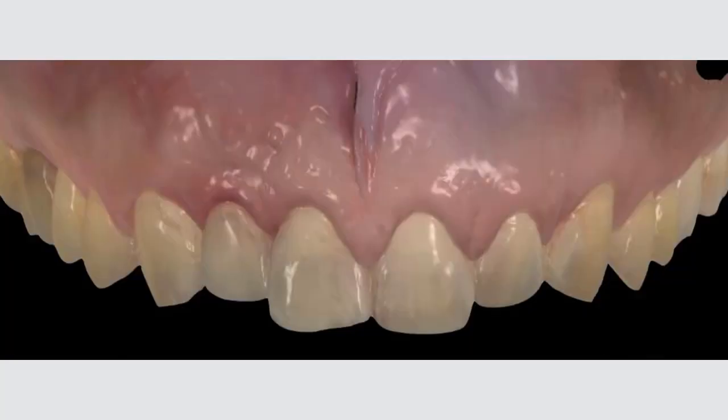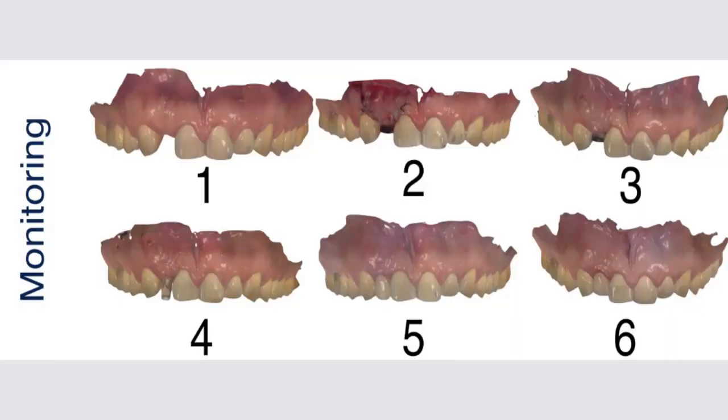But then what I do is I scan the patient less time. So I do this combination of 1, 2, 3, 4, 5, 6 scans during the healing process. And why did I do that? Remember that I have grafted the patient. I did a graft on the patient, and when we graft the patient, we never know what's going to happen.